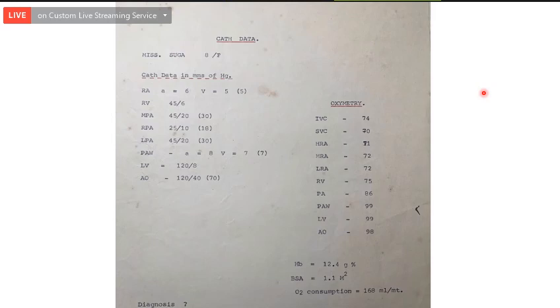11. Last is 5 only, sir. So at the great artery, it is 5 only. But what is the ventricular level? Ventricle, sir, multiple, I have 4. Multiple sample.